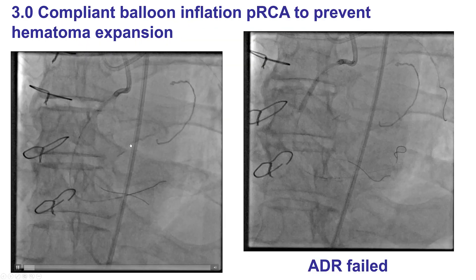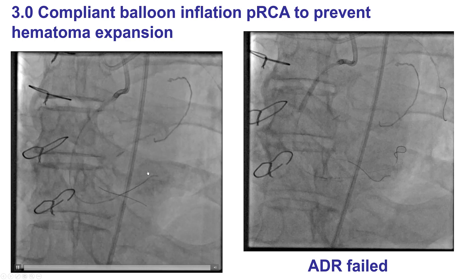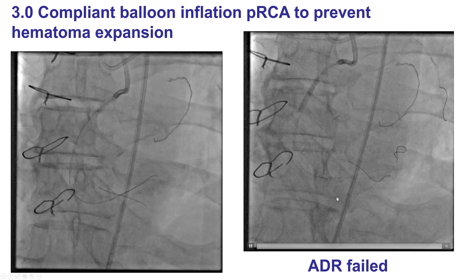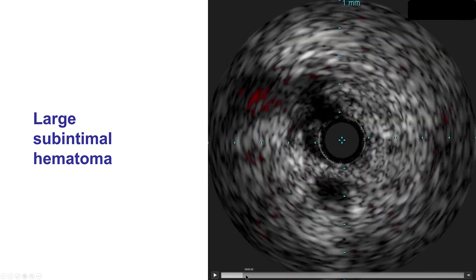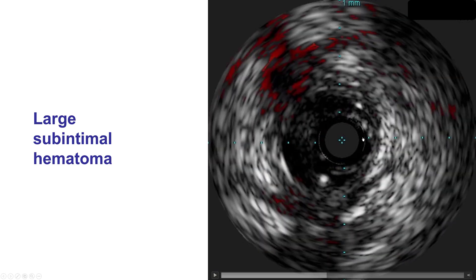We then switched back to antegrade attempts. There is a technique called the straw technique that can help decompress the hematoma created during antegrade subintimal crossing attempts. In this case, we advanced a balloon to block entry of blood into the subintimal space and then tried to aspirate through the stingray balloon, but once again that did not work. IVUS again showed that we did have a large hematoma — though this IVUS was done after successful crossing, it gives an idea of the large size of the subintimal hematoma.